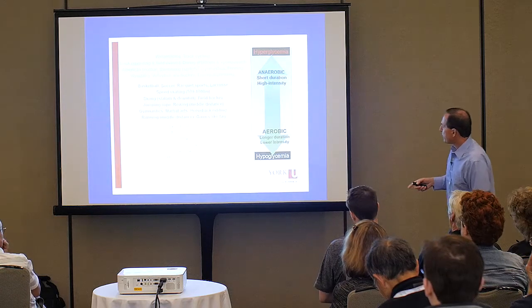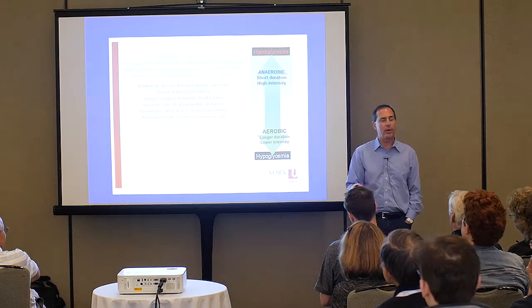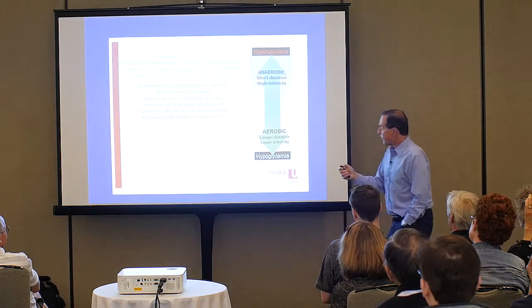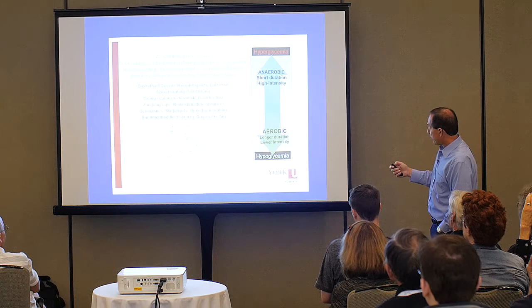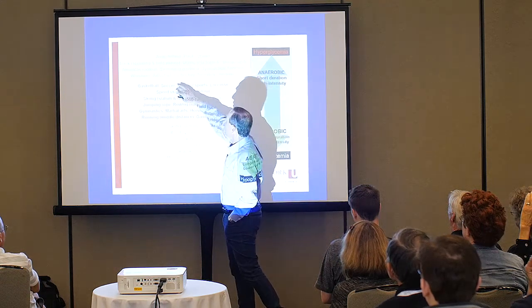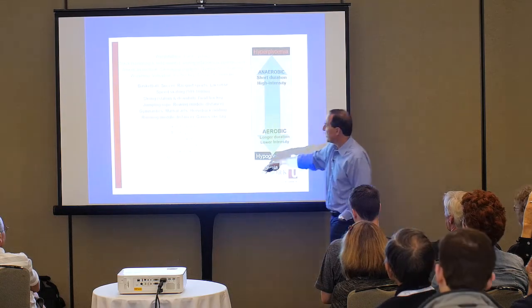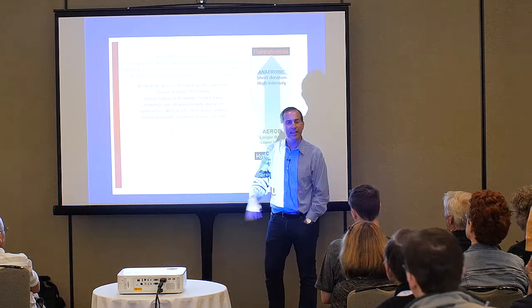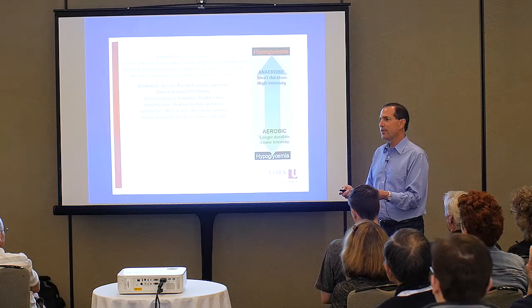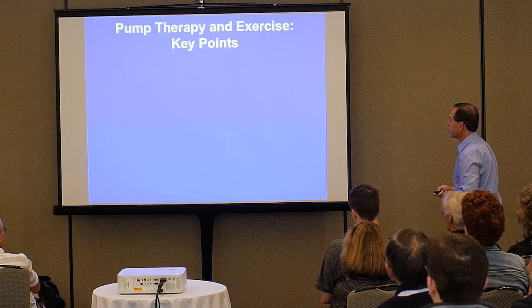This is by Mike Riddell, a friend of mine and a friend of Steve's, who's a kinesiologist, lives with type 1, and does lots of research on exercise and type 1. He's recapitulated here that certain activities from his research, intense exercise like ice hockey, track, and sprinting, raise sugar, and other things, as some of you already said, tend to make your sugar levels go down. So you have to adjust your pump to accommodate which of these activities you're doing and how you respond.